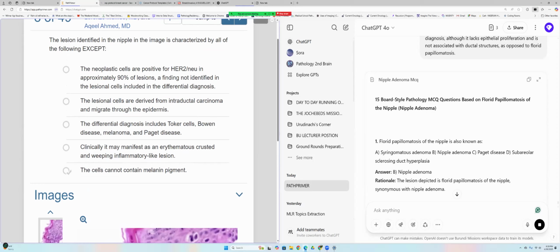So which one is different? This one is number one, the adenoma. I'll choose E. Different, circle it. Sit down. Sit down, Joe. I'll be begging you, sit down. Come and sit down.